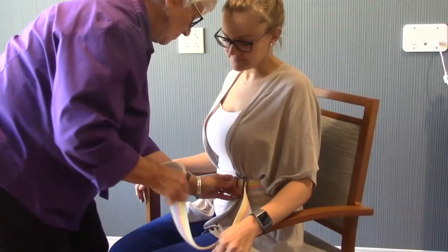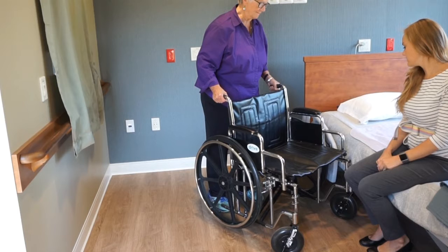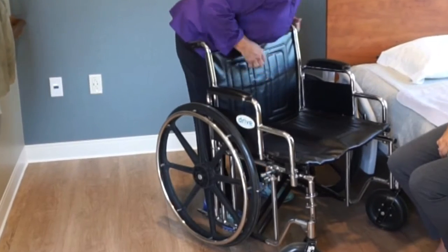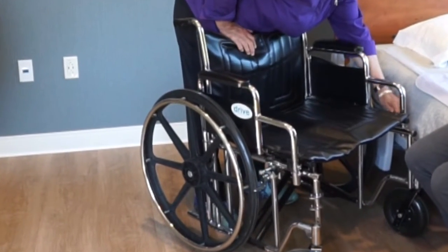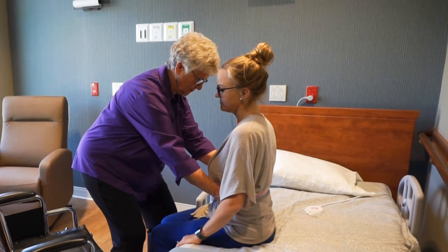Apply the gait belt. Place the wheelchair close to the bed with one arm of the wheelchair almost touching the bed. Lock the wheelchair wheels and fold the footrests out of the way. Hold onto the gait belt at either side of the person with your palms up. Maintain a wide base of support.